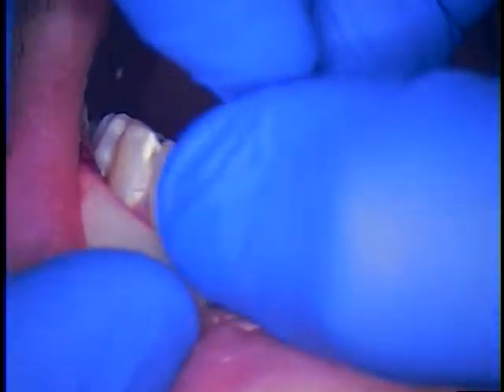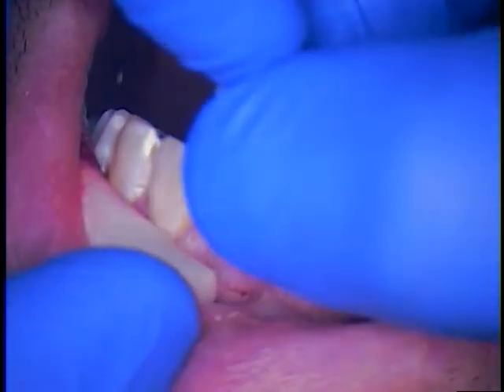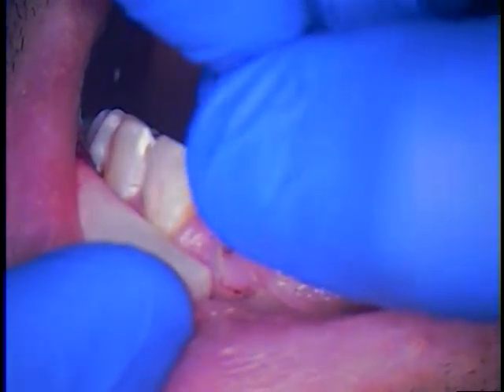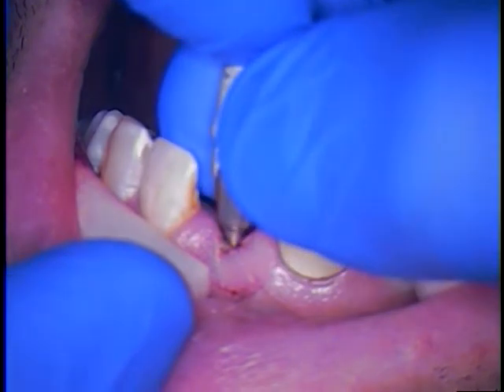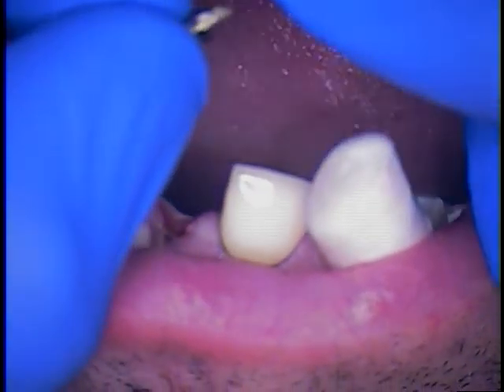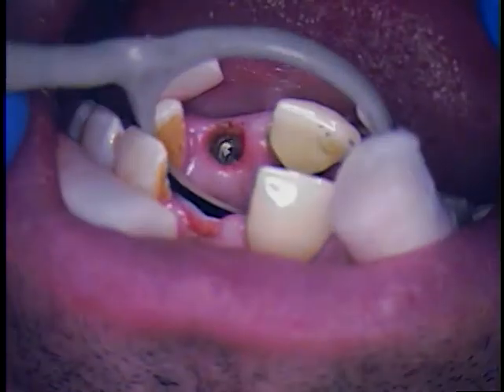Cotton pliers are ready. Okay, a lot of threads. Remember, we counted a total of, I think, so, yeah, you feel the clicking? That means we're ready to go. Once it clicks like that, we can take everything out. Here it comes. Now we can measure this, but there could be a sleeve in there. Let me see if the sleeve is in there.